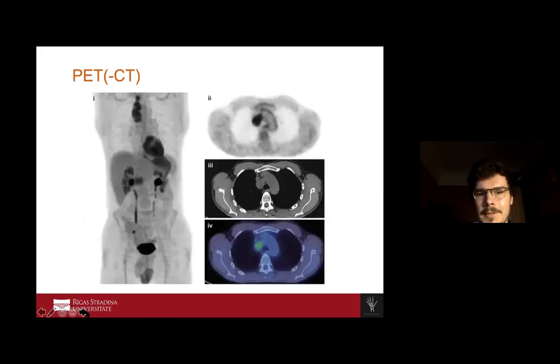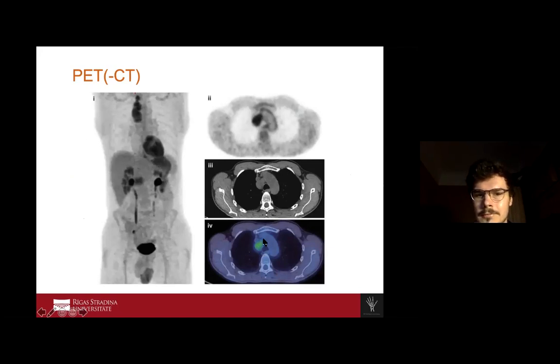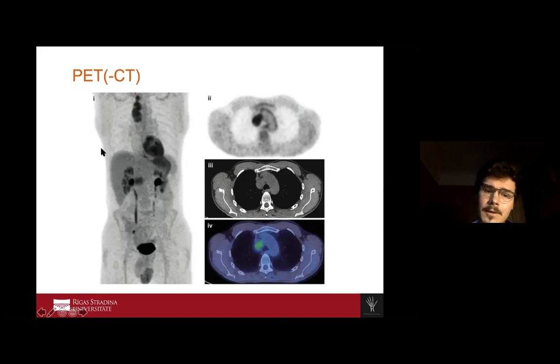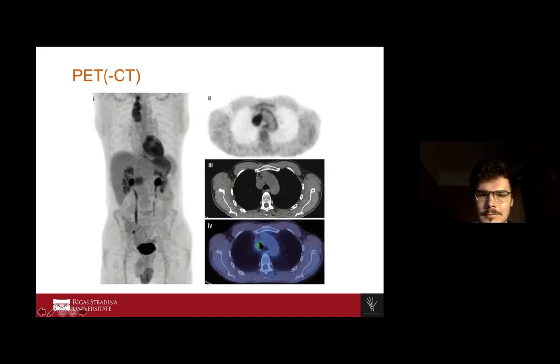Here we see a PET-CT. First we see the gamma camera picture, then the CT — the anatomical picture — and combined, we have this image with the shiny and sparkling spot. In this patient, a male with Hodgkin lymphoma, we can see the black dots on the gamma camera picture and the shining projection on the CT.